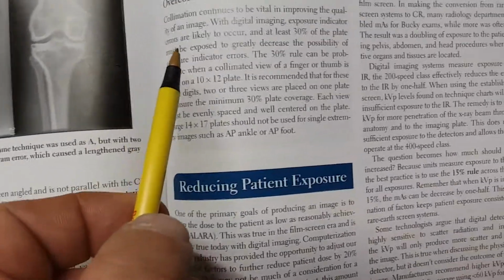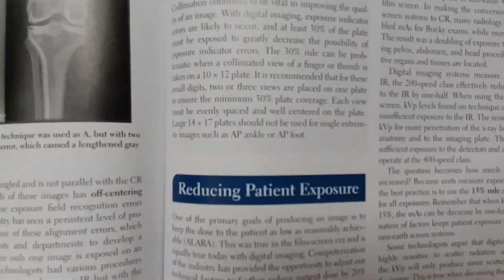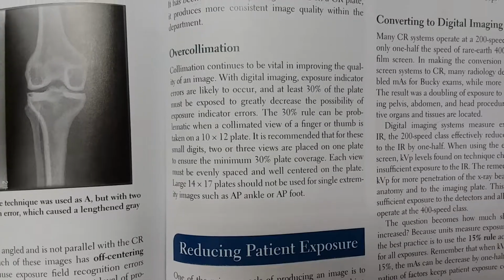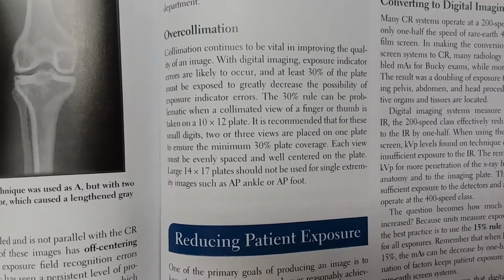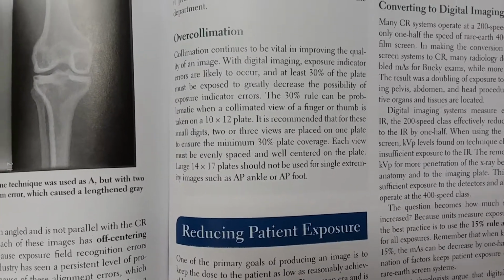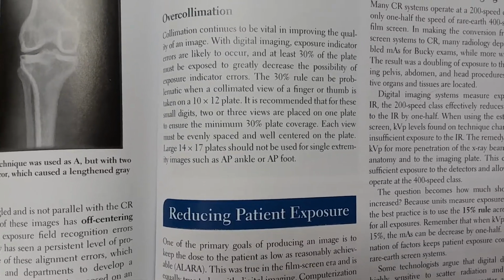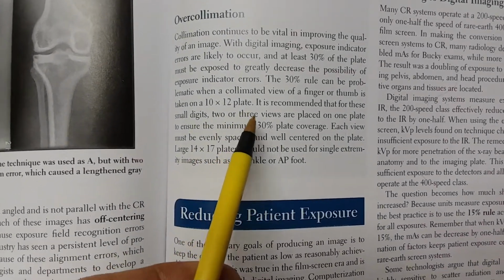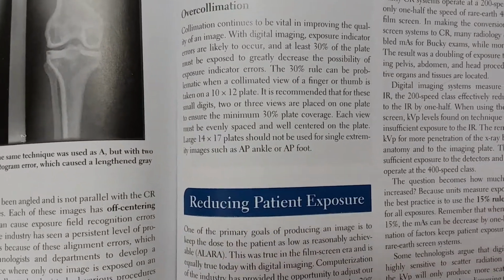And then on the next page, 283, it talks about overcollimation, which it says there that collimation continues to be a big deal with digital imaging because at least 30% of your imaging plate, it says, needs to be exposed to avoid histogram analysis errors. So you need to use as small a plate as possible and then open the collimation up to cover at least 30% of the plate in order to get an adequate image.